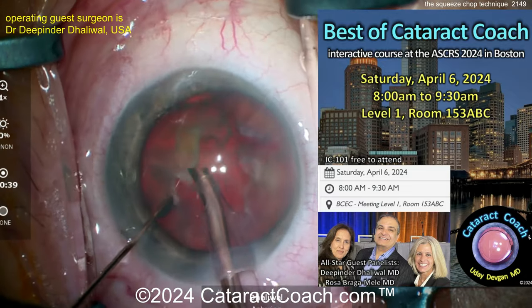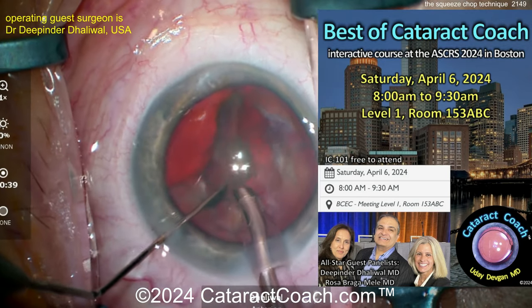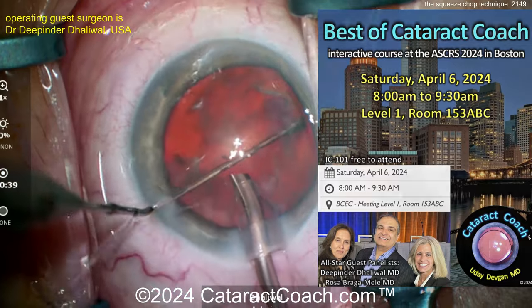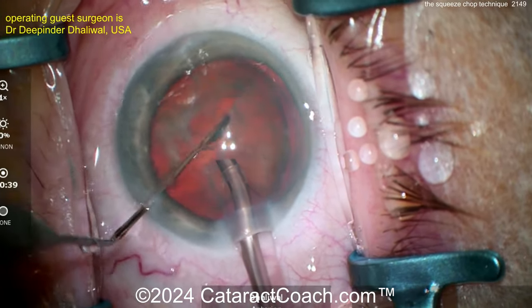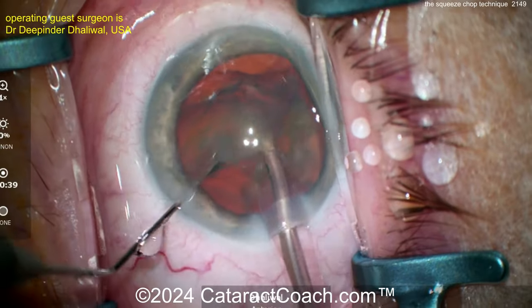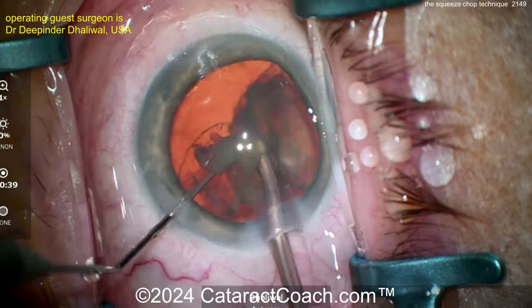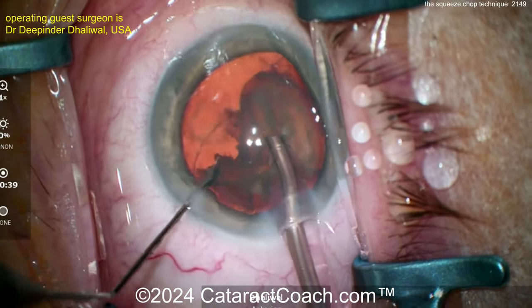At the end of the case, you can have an epinuclear shell — you can see it being wolfed down here. I like using that second instrument, that spatula, to rotate the pieces around and feed them into the probe. It's a thick epinuclear shell, and here's the trick: flip it over. Once you get it flipped over and pull it out of the bag, it goes down pretty easy.